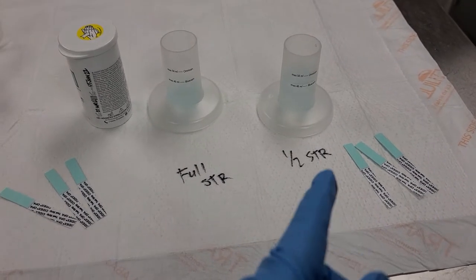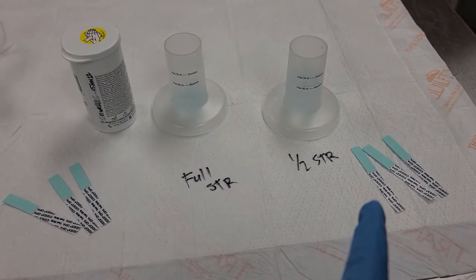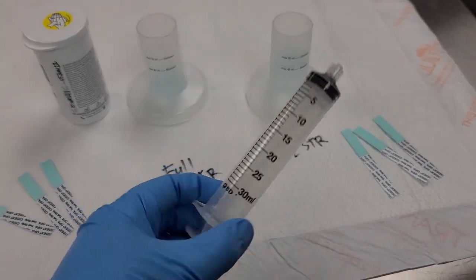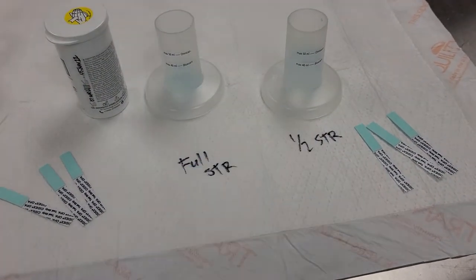To achieve half strength, you're going to put in equal parts Cydex and equal parts sterile water. This can be done with a syringe, just make sure you put 20 and 20, 10 and 10, whatever gives you a good solid amount.